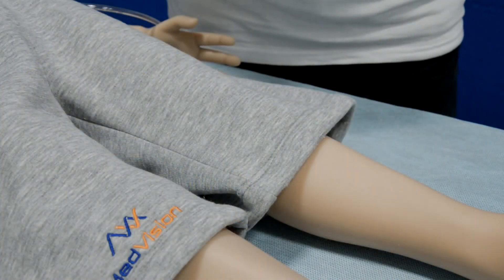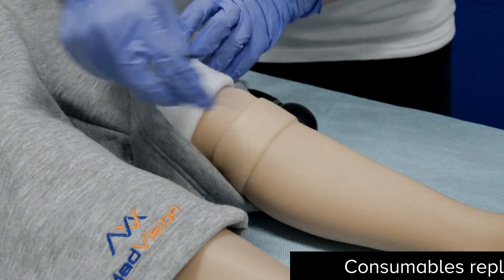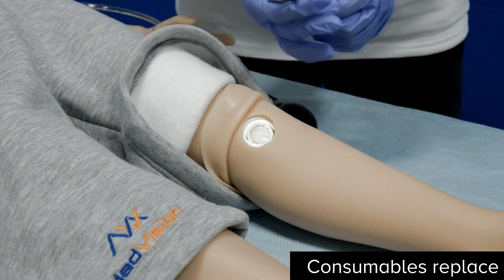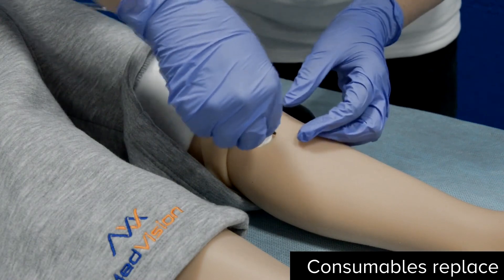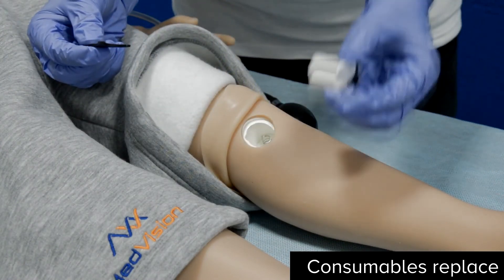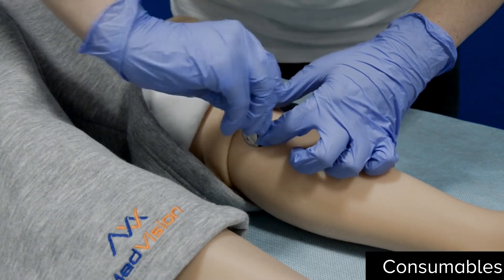Arthur has IO access on both legs. To remove the consumable element, remove the silicone band and use the special key that comes with the patient simulator — rotate and remove. Then take a new one, insert it, and rotate to secure.